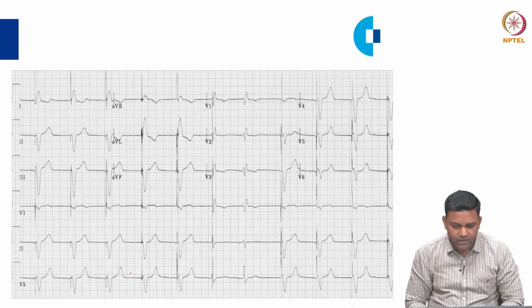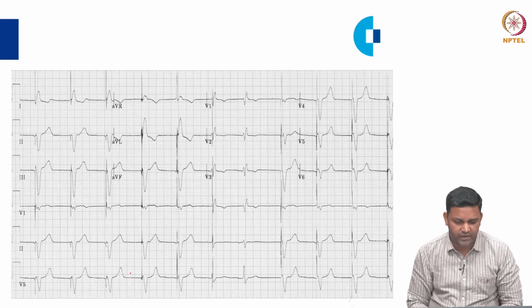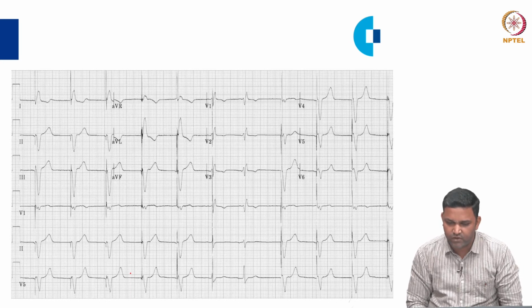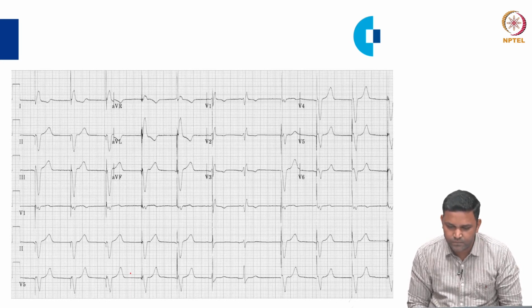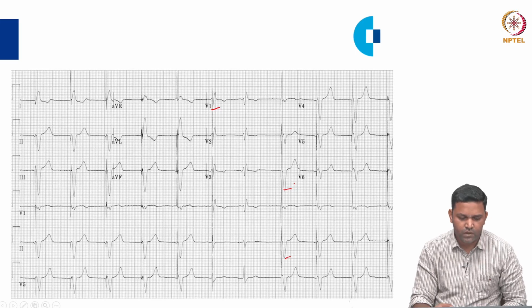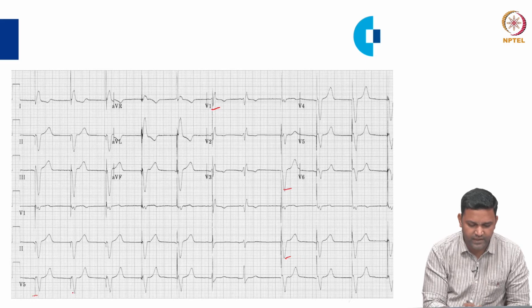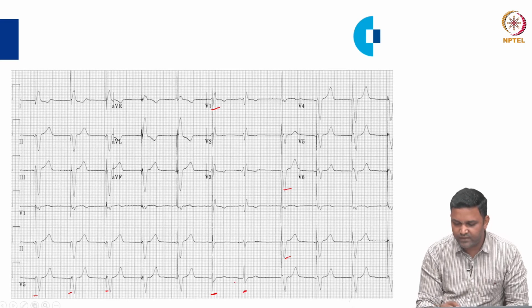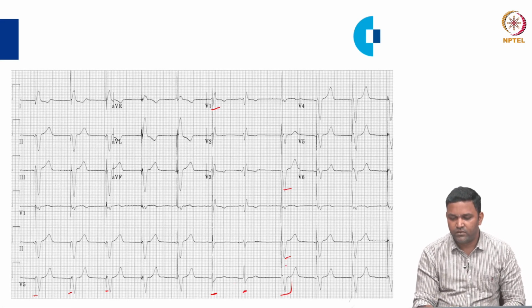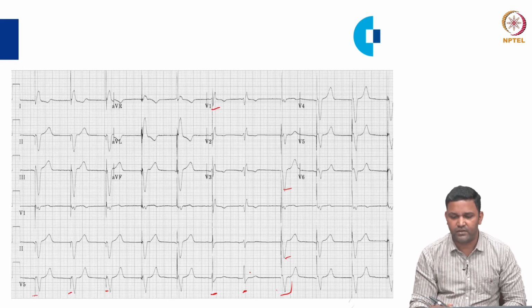So, this is another example, and yes, this is a ventricular pacemaker, right ventricular pacemaker, because of the LBB morphology. This has a slight RBB morphology in the leads which are the native beats. Otherwise the paced beats are all in the LBB morphology. So, before the ventricle is paced, you can see a pacing spike in the ventricles before the QRS complex, and these two beats are not wide. So, this is the beat which is produced natively from the patient.